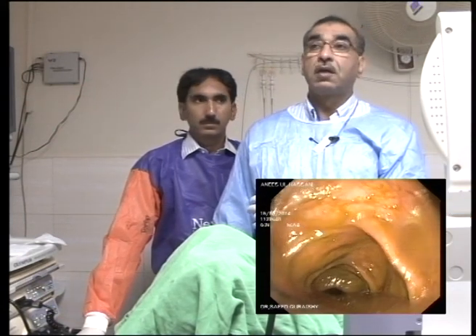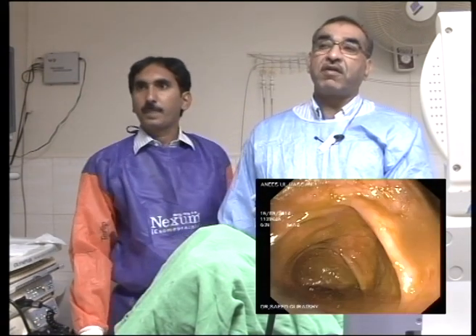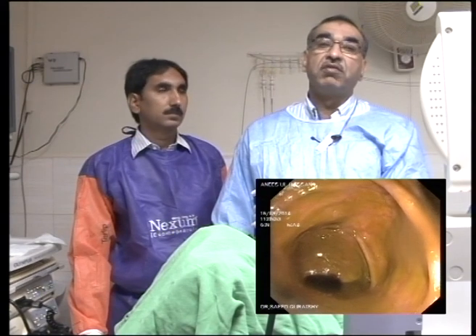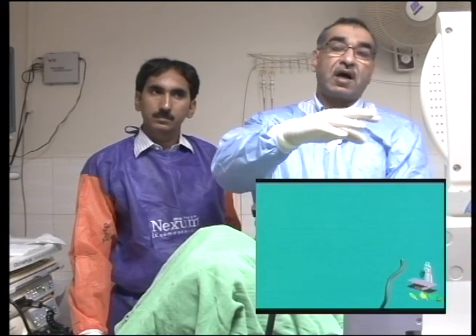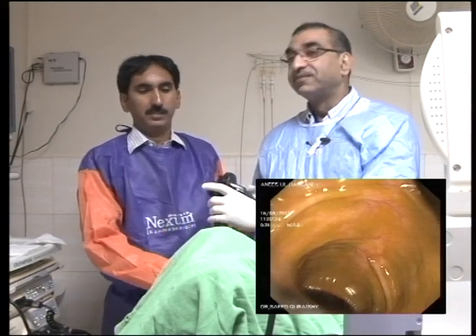Waqar, the patient is supine, so you actually change the patient's position. Normally, if you are in the sigmoid colon and you are having a bit of difficulty with looping, it's always a good idea, because if you change them to supine position, it gives you a 90-degree advantage in torque. So it makes life easier. Now, if you look at the scope guide screen, we can see it's very straight. So that shows that now it's a piece of cake for him. He can just go through. The only problem here was that the patient was very distended, and in fact he was burping up wind, which means that it's seriously overinflated. So I've just decompressed him, and now you can take over, right?